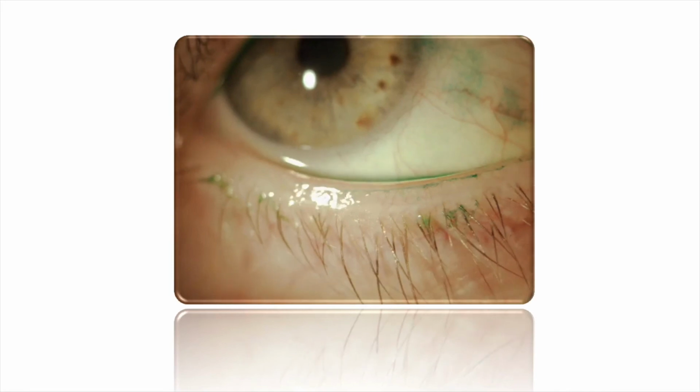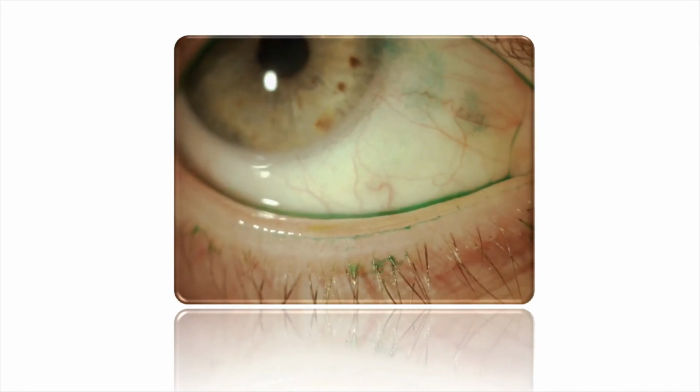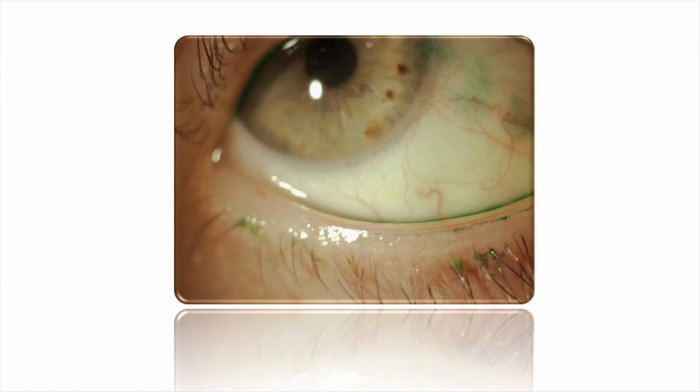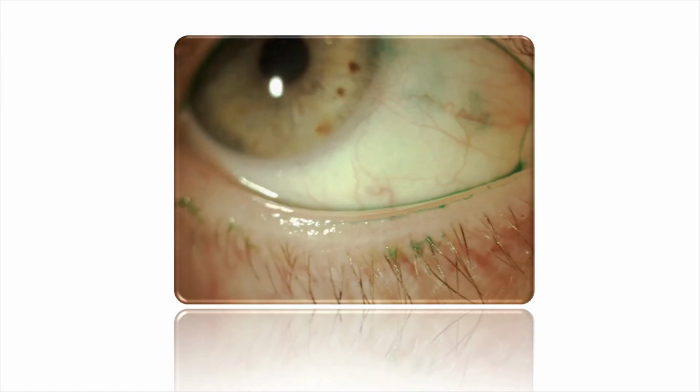And we use it most often for dry eye disease, but recently we've really begun to use it for lid margins and in looking at conditions that we're going to review a little more in depth in Clinical Insights episode number 4, and that's lid wiper epitheliopathy.